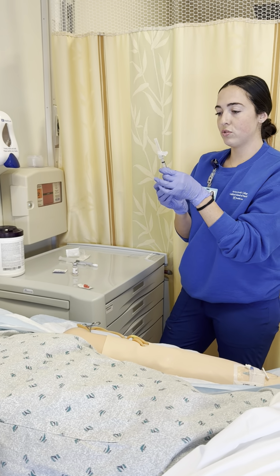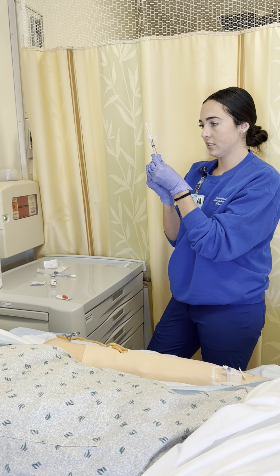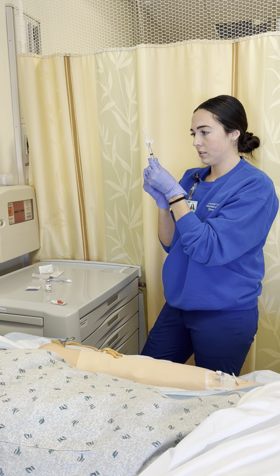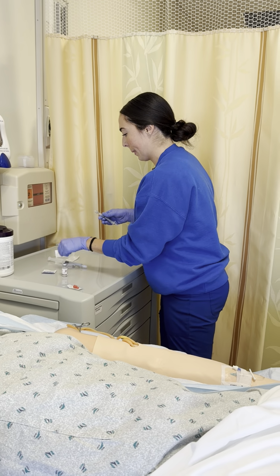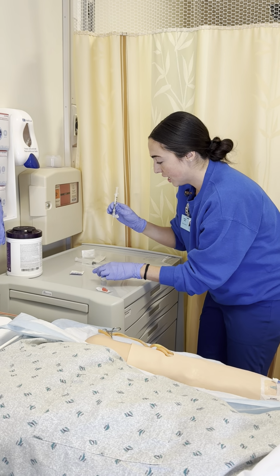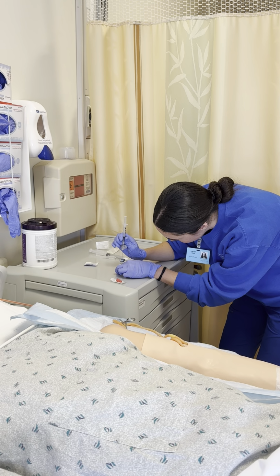So I'm going to draw up 1 milliliter of air. Okay. And I am going to remove my cap. All right. So now I'm going to inject 1 milliliter of air, being sure not to touch the liquid.